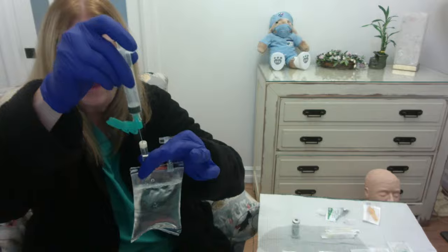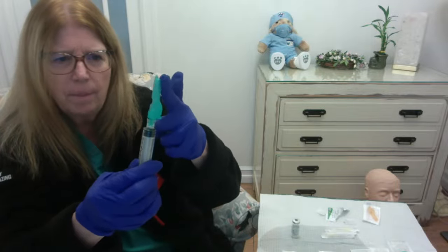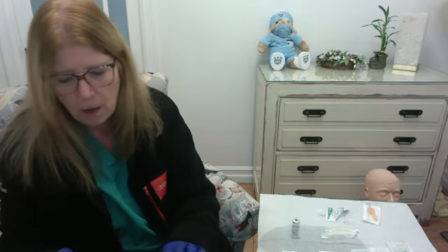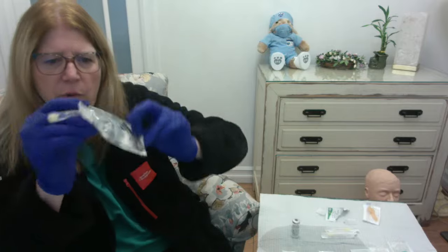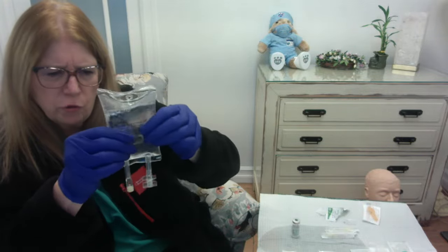I'm going to take this out, and I am going to engage that safety. Click it into place. Now I can put that in my sharps container. Please remember that all syringes, whether there's a needle attached or not, go into the sharps container. So now I've put that medication into this bag. I can just flip it around a little bit, make sure it's evenly distributed.